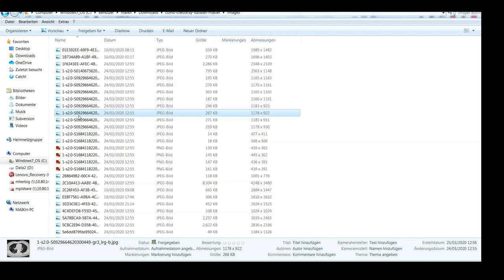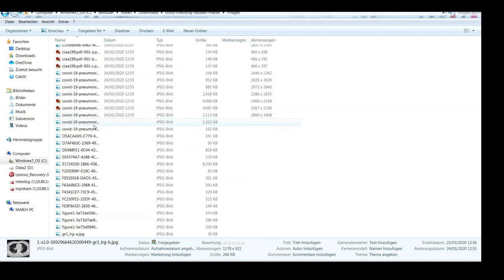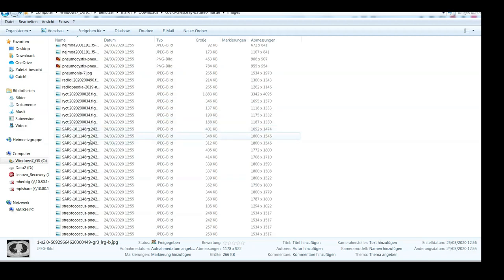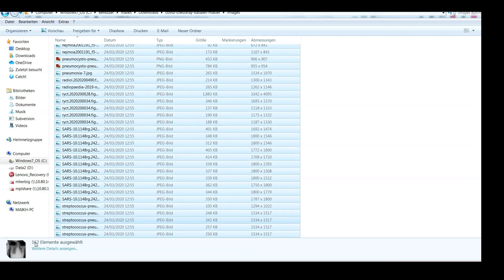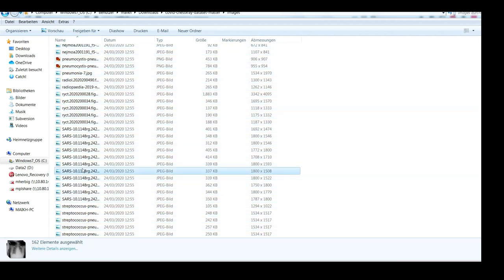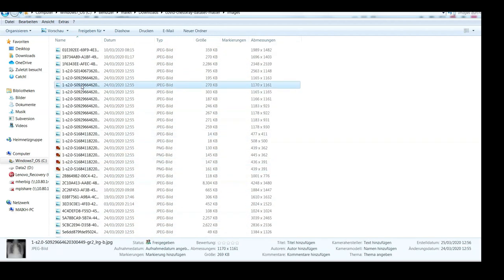So this is a problem termed overfitting. In general, overfitting will be the biggest problem that we are facing in this dataset because it has only 162 elements. And at the same time, I would suspect that we actually need a fairly complex deep neural net in order to facilitate this complex classification task.